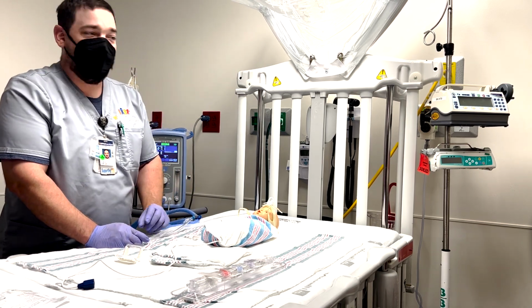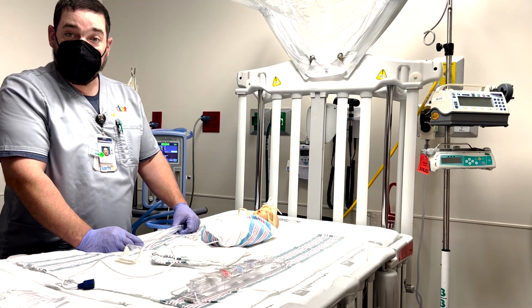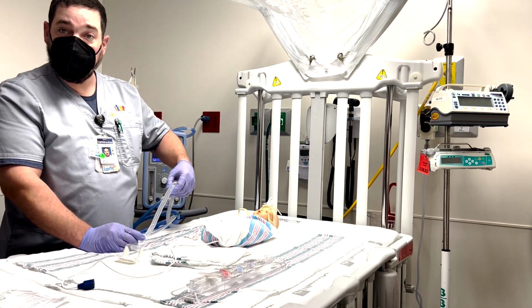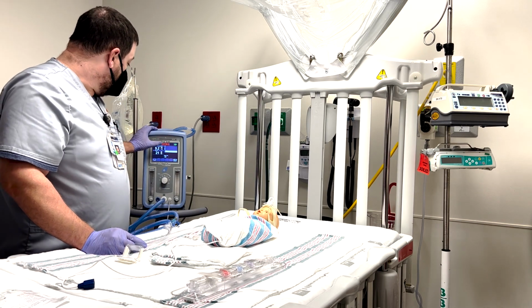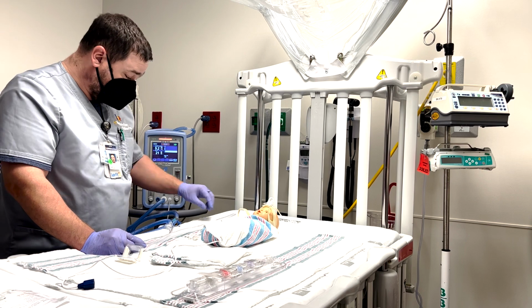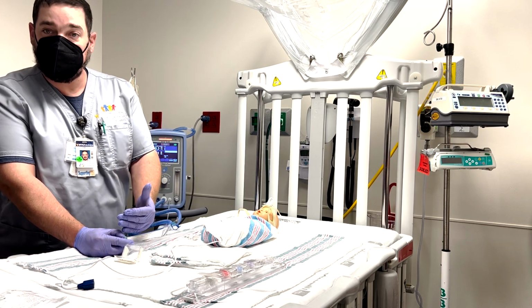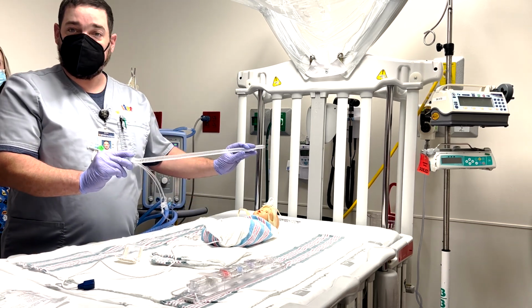So, all right. Any questions about that little piece, like the clear piece here? I just had a baby that was on this, and that piece just dangles in the wind. She said to just put a chux under it, because as a nurse, if I had come and seen that, I'd have thought it was unhooked somewhere. Okay. I didn't know that was a thing. No, that's all right. So what this piece is, it's actually a way for the baby to breathe out. This is a single limb, so it's giving flow in this direction. So it's got to have some way to vent. So all this is just an exhaust pipe.